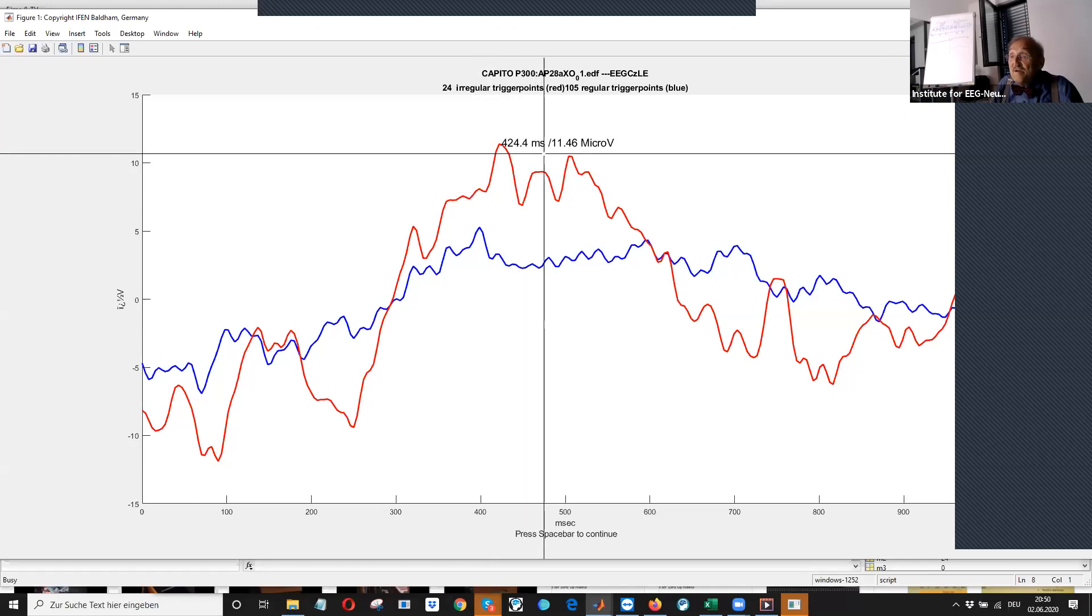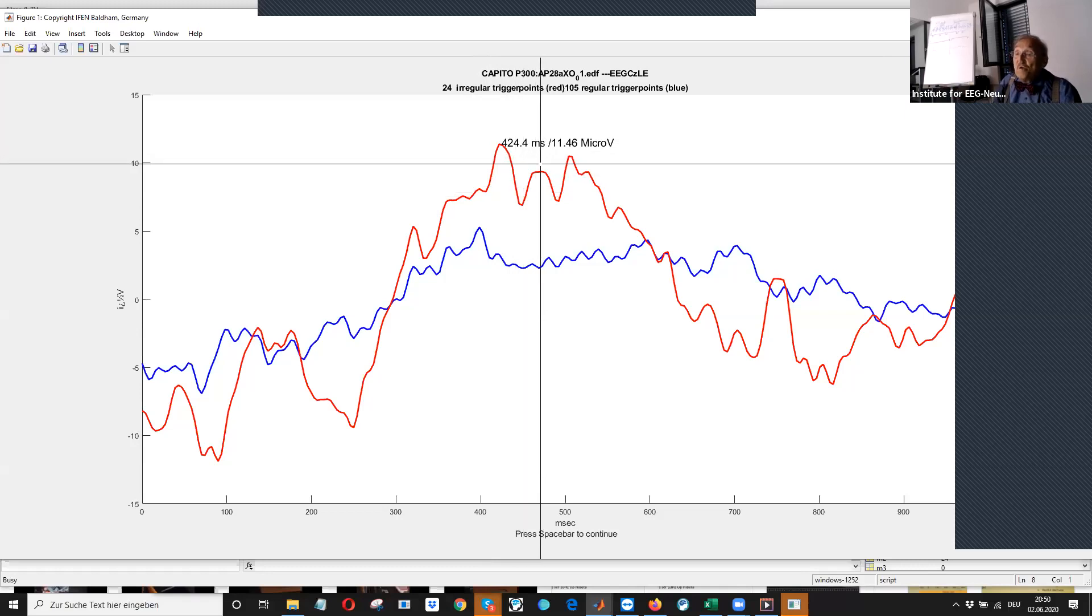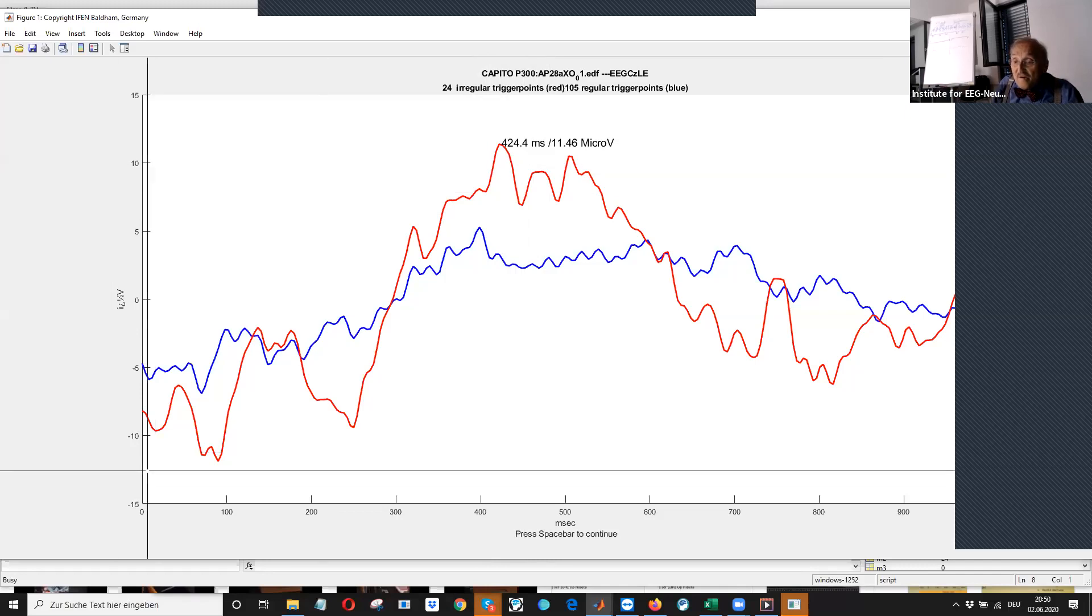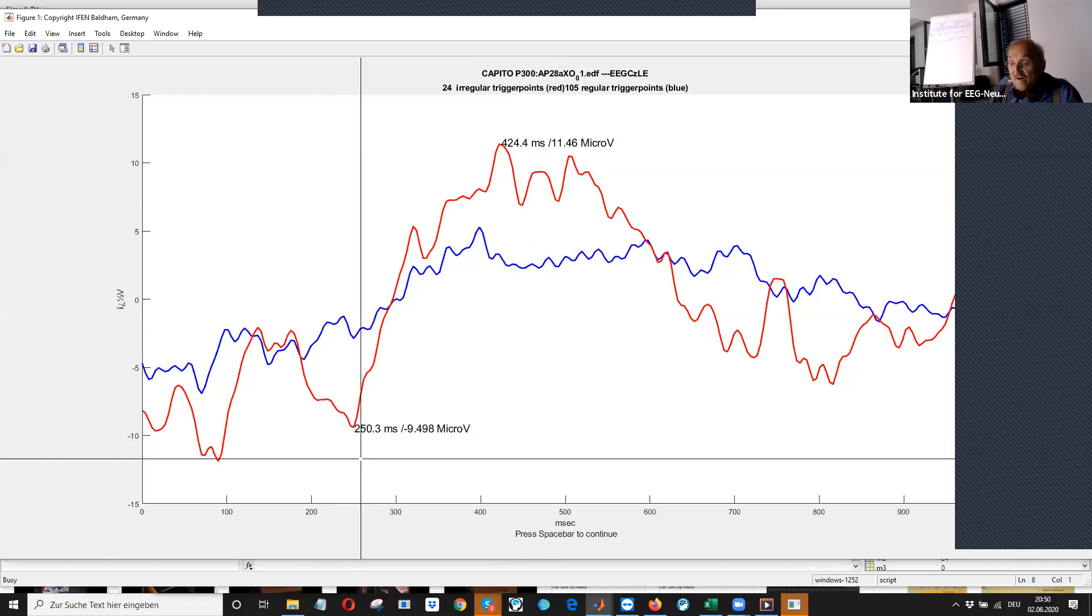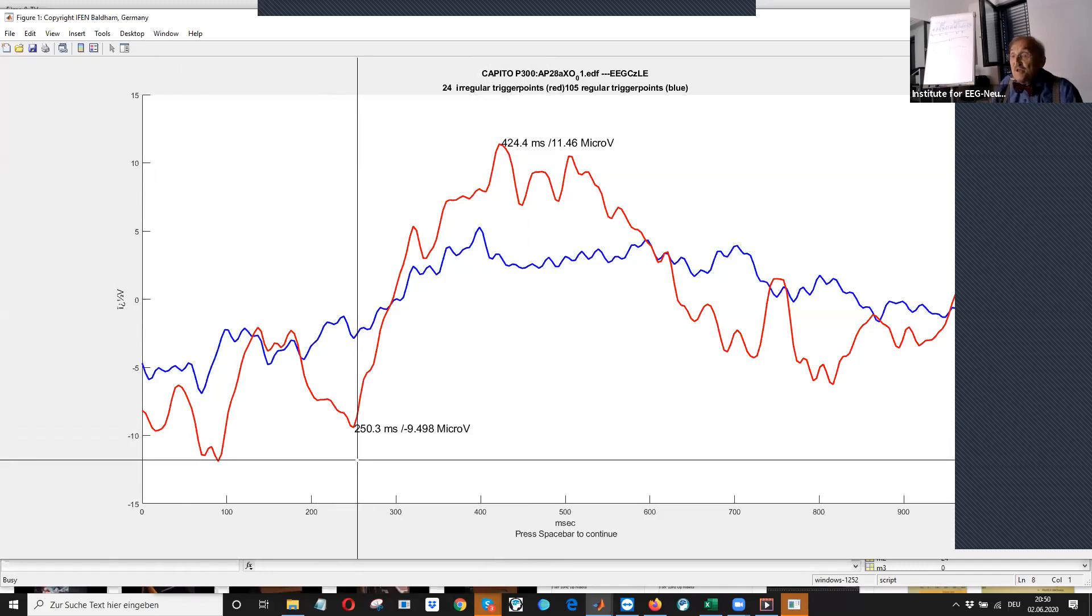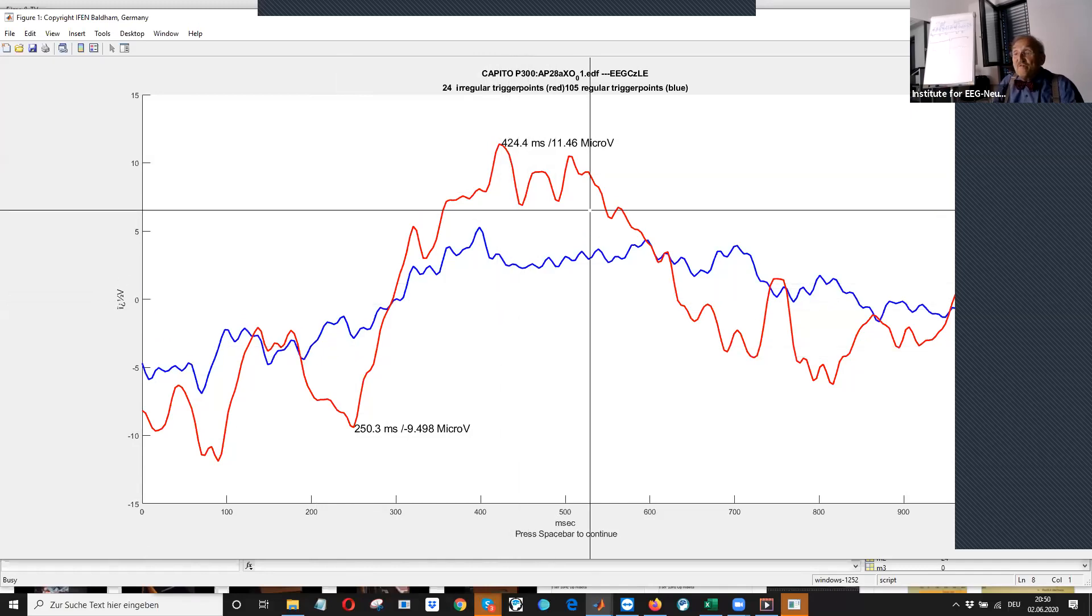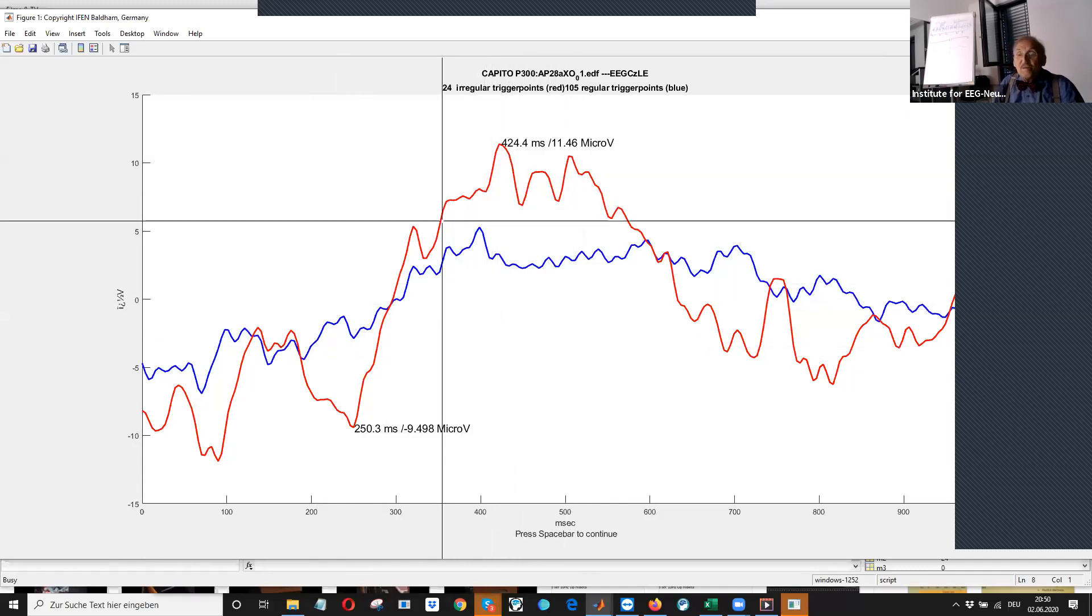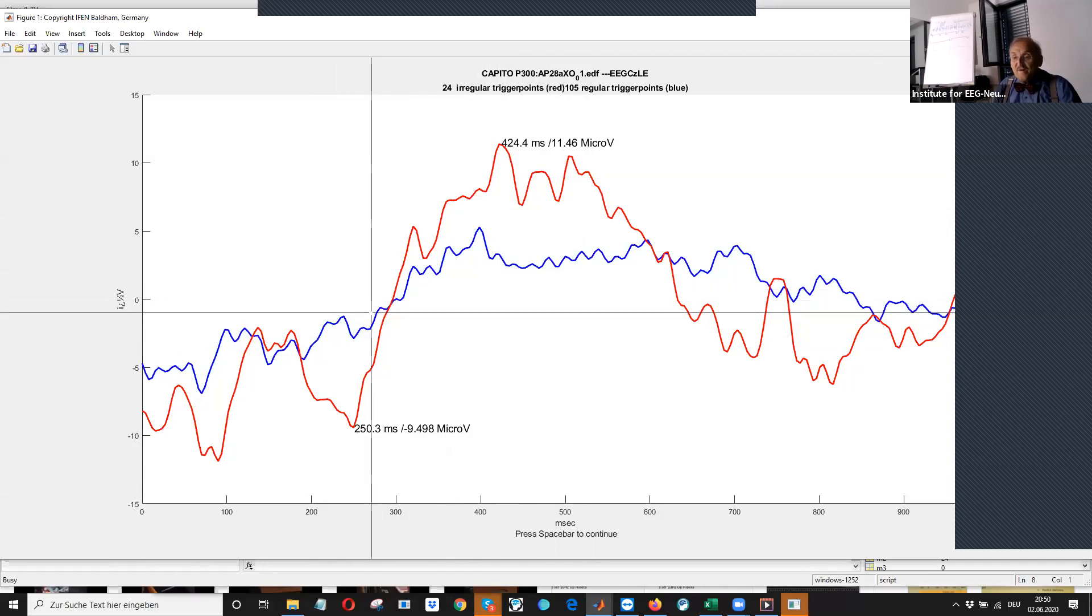amplitude is from, let us say it is from here, from minus nine to plus 11. So almost 20 microvolts. It is very high. Yeah.